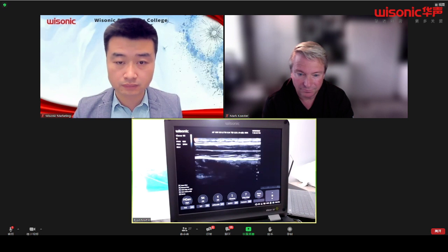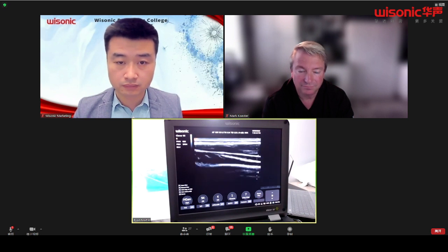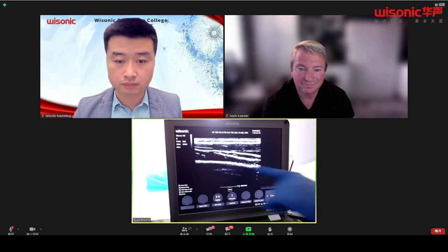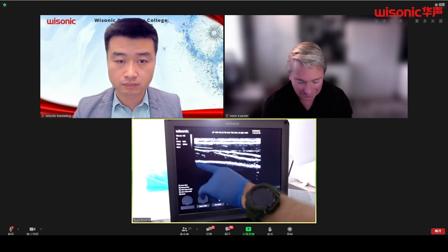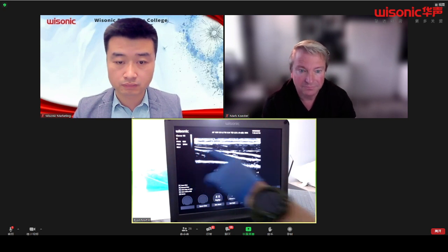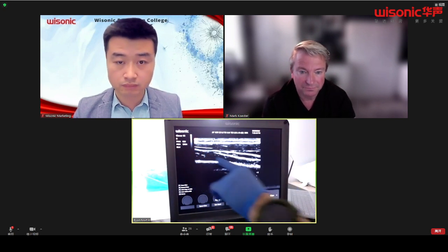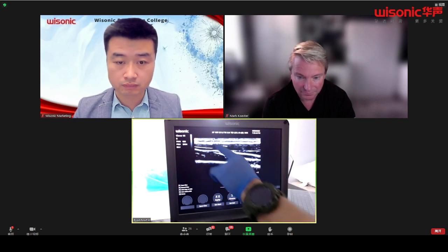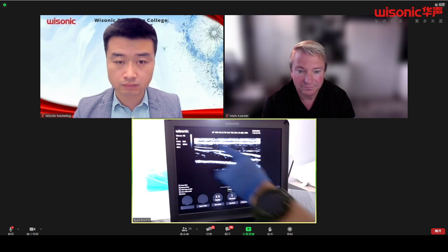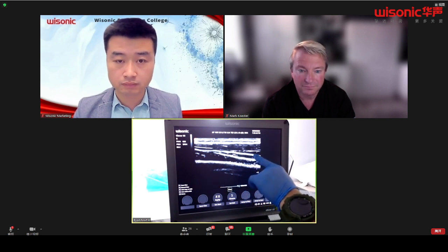While we're here, we're in the same exact space. We're going to look at that humeral shaft, right? There's that humeral shaft. And what I want to show you all is this picture right here. So again, we have that radial shaft, I should say, not humeral, radial shaft right here. Right up in here, we have that more common area of the radial nerve. And then as it bifurcates, you can see one strand down here, one strand up here. That's going to be your PIN, your posterior interosseous nerve. And this one right here is going to be that superficial radial nerve.